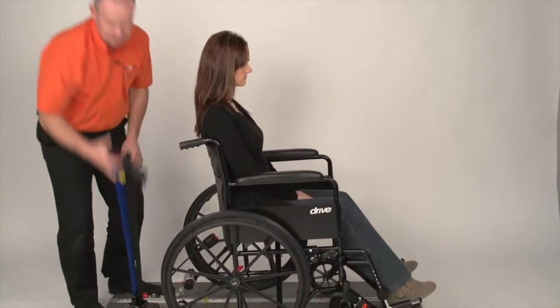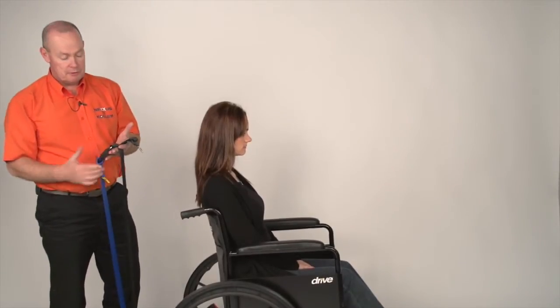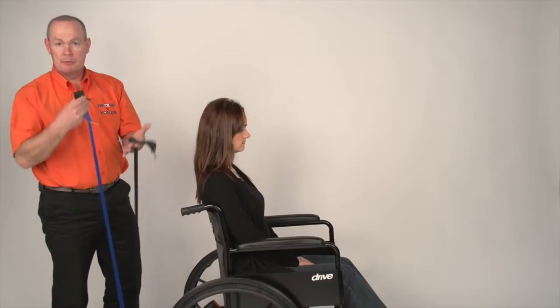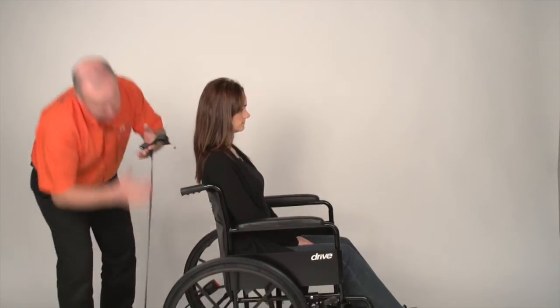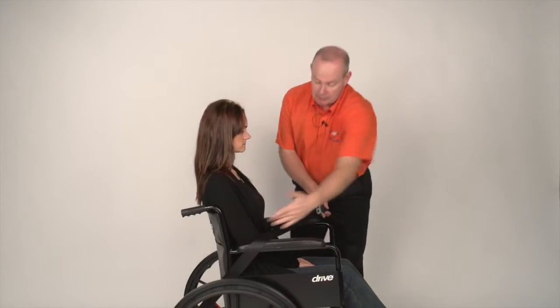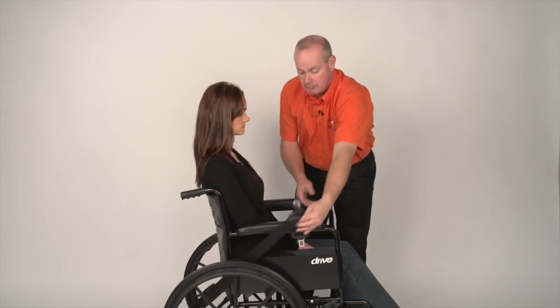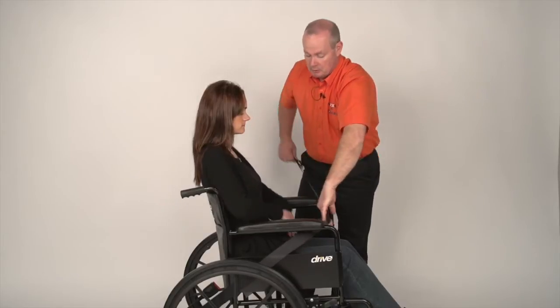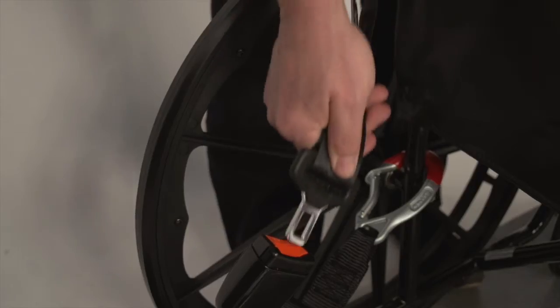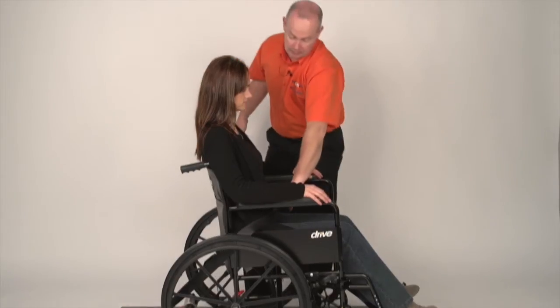Putting the passenger harness on — there are split-reel inertia reels, black and blue, so they're colour-coded for easy use. Black is the lap, blue is the diagonal. Taking hold of the lap strap, bring it around the person — you'd either come down through the gap in the armrest or the gap underneath the armrest. Poke it through to the other side, put the tongue into the stalk, and lower it into the lap.